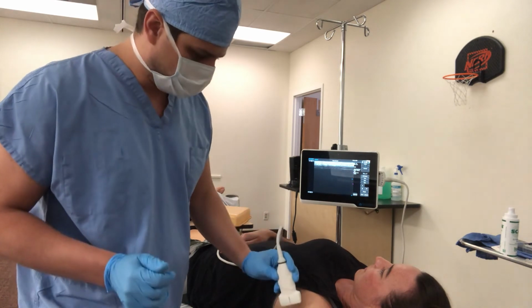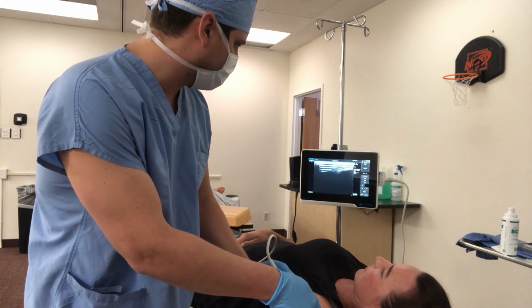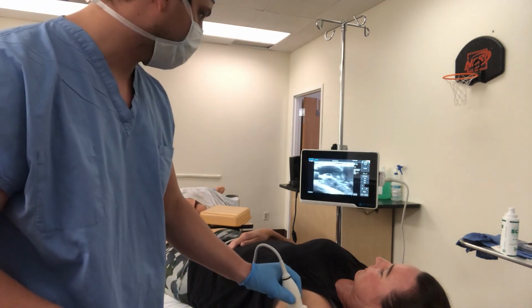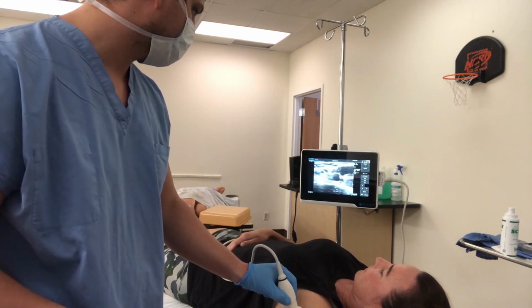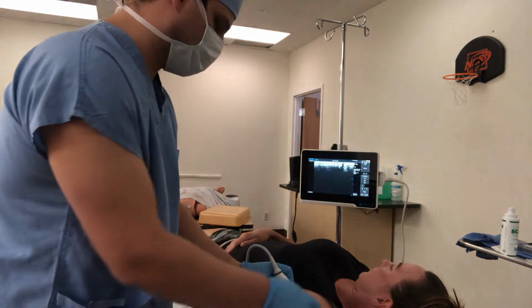So I'm going to put the ultrasound high at the crease and locate the axillary artery.